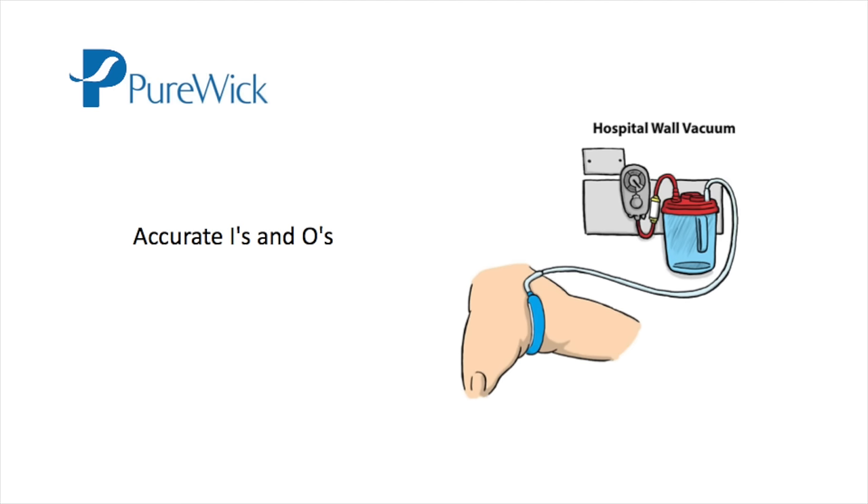Purewick can be used for accurate I's and O's. It can also be used to collect urine for analysis, similar to a clean catch, as long as the perineum is cleansed and you use a fresh wick, tubing, and canister.